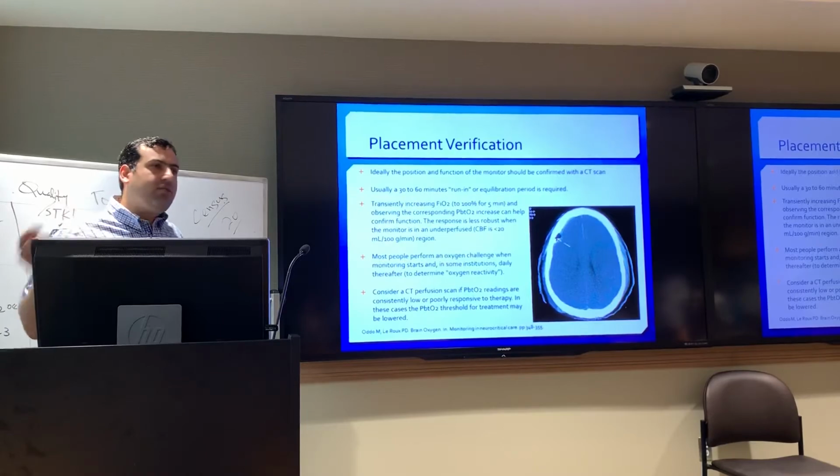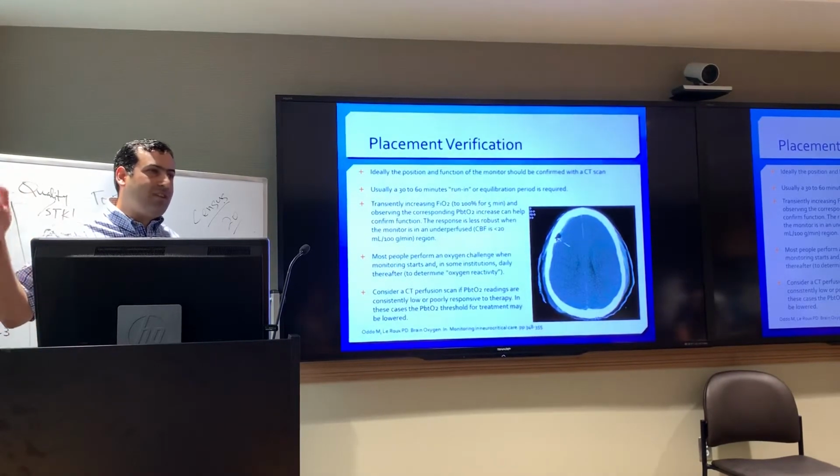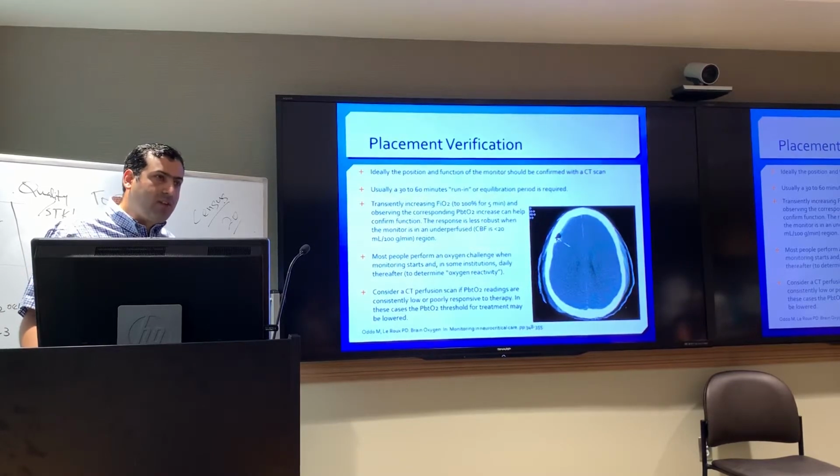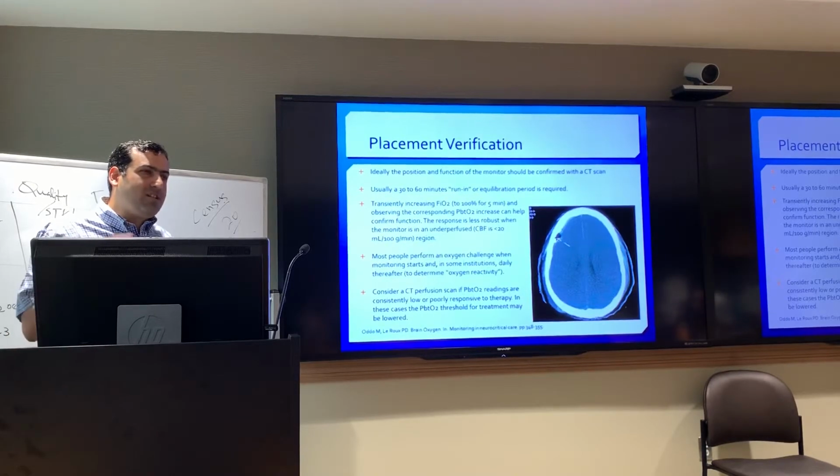But I think if you do the challenge within minutes, you don't need to wait days. It's a reliable trend, and it's an accurate number. It's just a surrogate for what we don't know what it is. But the number is right.